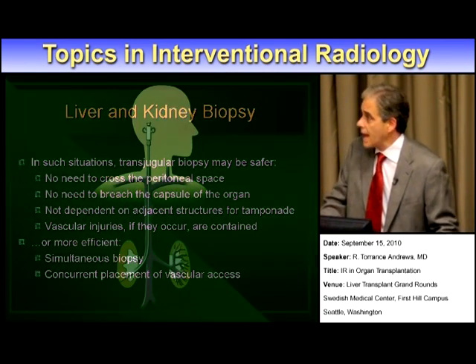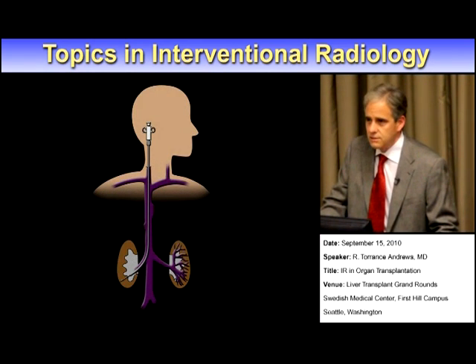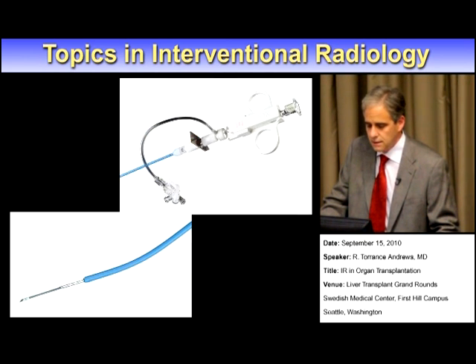This is the schematic of a patient who's having a transjugular renal biopsy. The device is passed through the jugular vein under ultrasound control. There's a rigid cannula, demonstrated in this slide, that advances into the renal vein, and then through that we do a coaxial core biopsy.